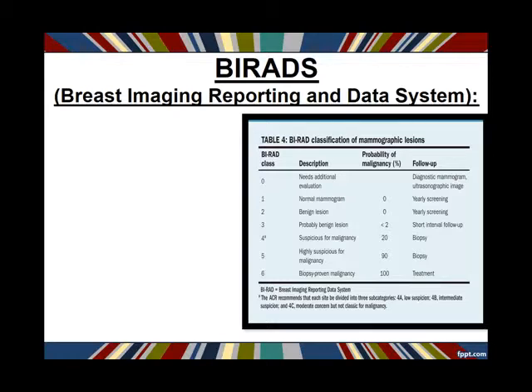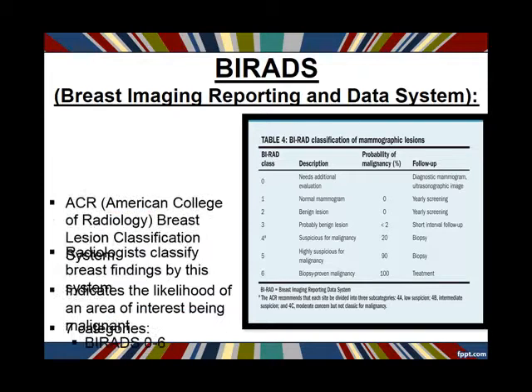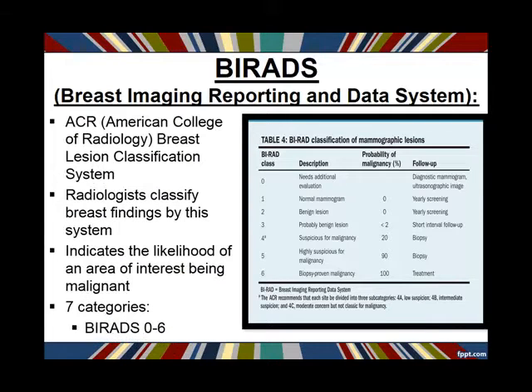BI-RADS is really important to know if you go into breast imaging. Doctors talk in BI-RADS — this is how they communicate on pretty much every case. Often a radiologist will not give me a result like 'this is a cyst, go tell the patient.' They'll say 'benign, BI-RADS 2.' So I need to know what these BI-RADS categories are.